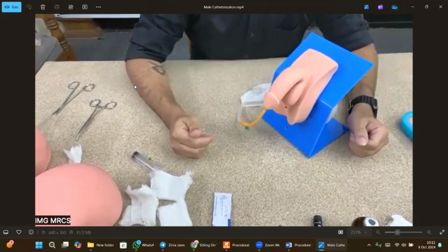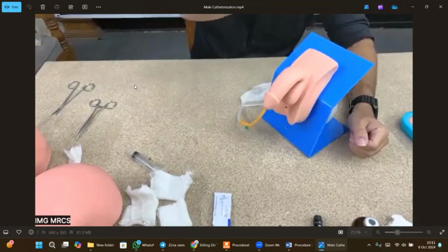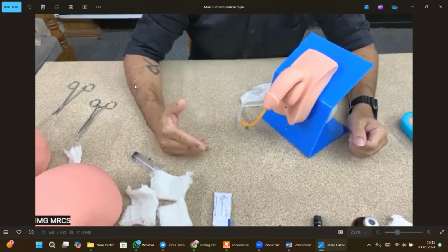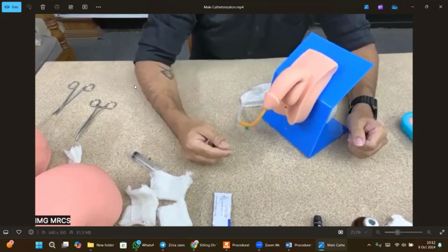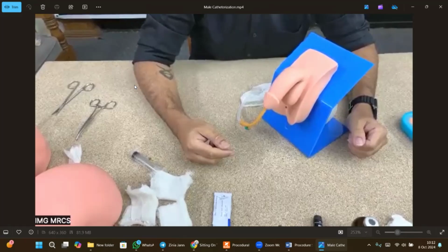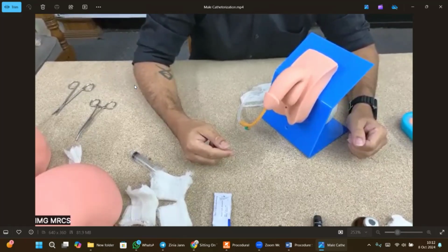And were there any sharps that we have used in this case? No. Okay. At this point, we are going to give some advice to the patient, okay? There will be no pain, because we have already given some numbing agent. But if the pain is increasing, or your tummy is getting distended, if you feel feverish, or if you see blood coming out, please contact the nurse immediately.